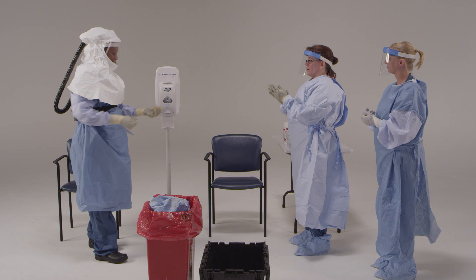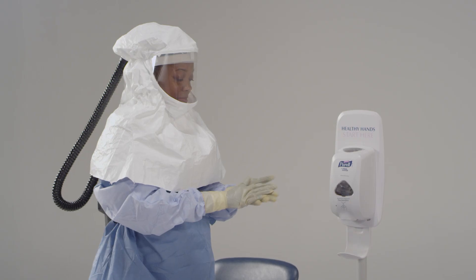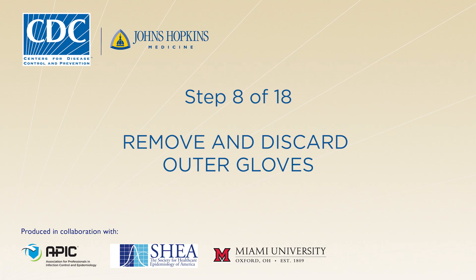Now you will need to disinfect your outer gloves with an EPA-registered disinfectant wipe or an alcohol-based hand rub. In the next step, you're going to remove your outer gloves — please do this slowly and carefully to avoid contaminating or tearing your inner gloves.